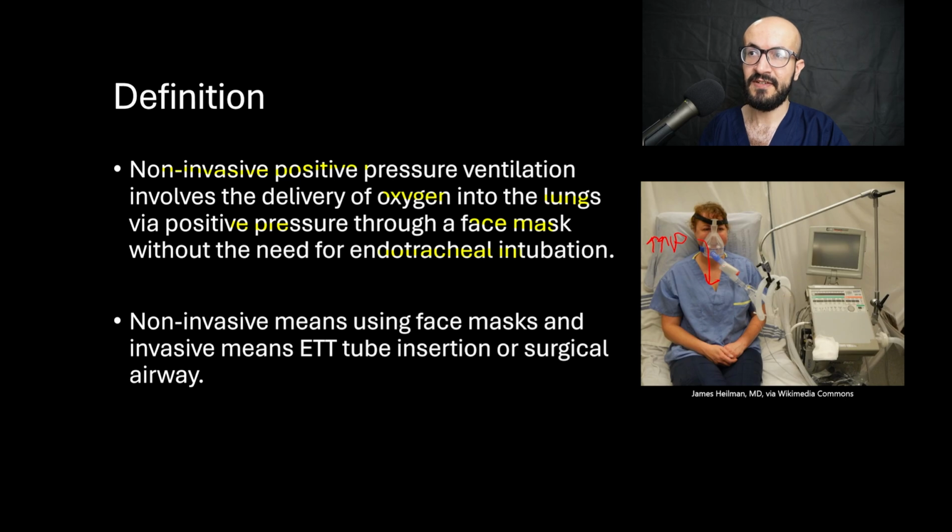It is achieved with a sealed face mask, like you can see here, and a ventilator, like in this case, or a standalone device. This device is pumping the air through at higher pressures to make it easier for it to go through the lungs, and this leads to less respiratory muscle use, meaning the patient would be in less respiratory distress.